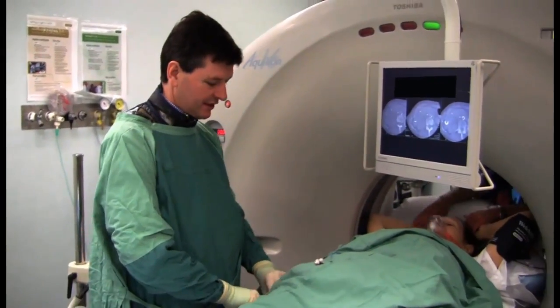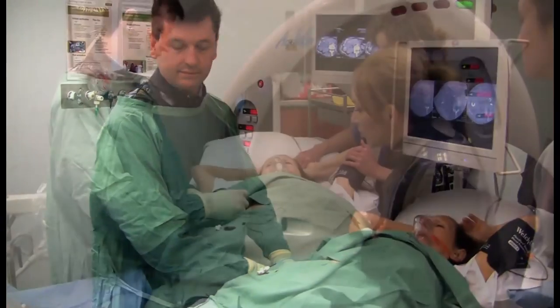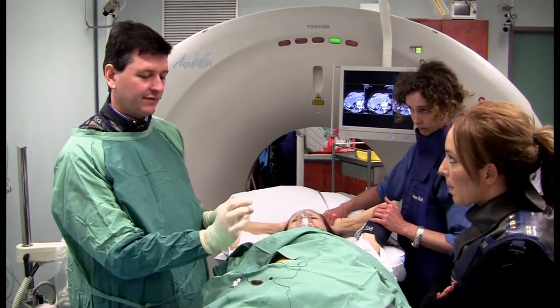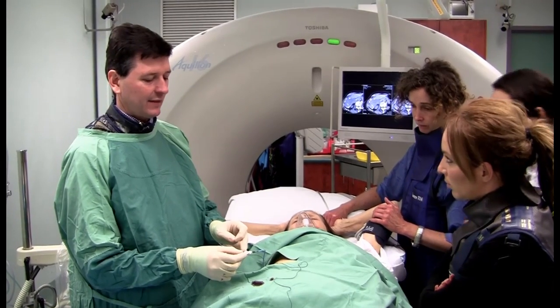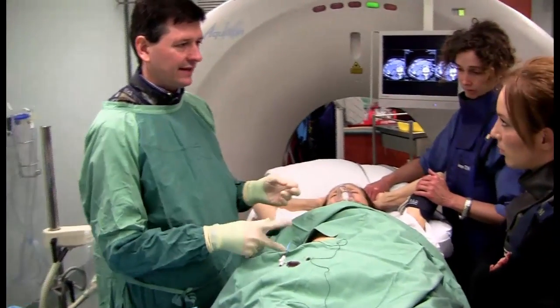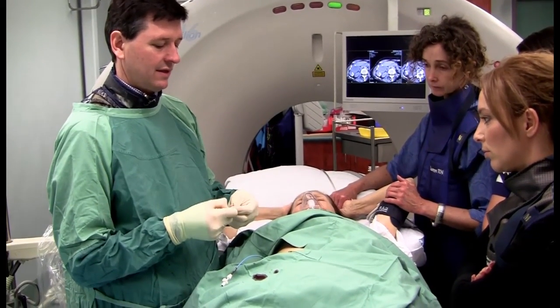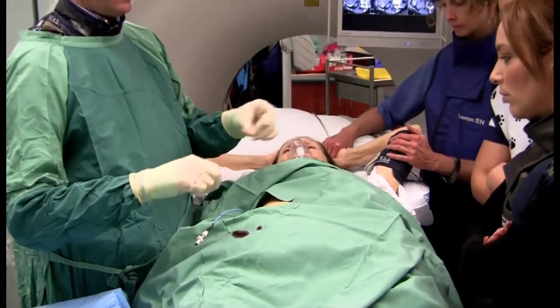Now we're going to attach the drain — very straightforward. This drain is attached by multiple means. It's a self-retaining drain: when you pull on this thread, that brings the end of the drain around into a loop, which stops it pulling straight out. That's locked by turning it so the little black triangle faces the word 'lock'. To unlock, turn it the other way. The easiest way to remove a drain like this is to just cut there and pull the whole thing out — that cuts through the thread and the body of the drain. We then apply a little suture as a belt-and-braces manoeuvre using 2-0 silk, making a little reef knot to form a stable bite that stands off the skin.